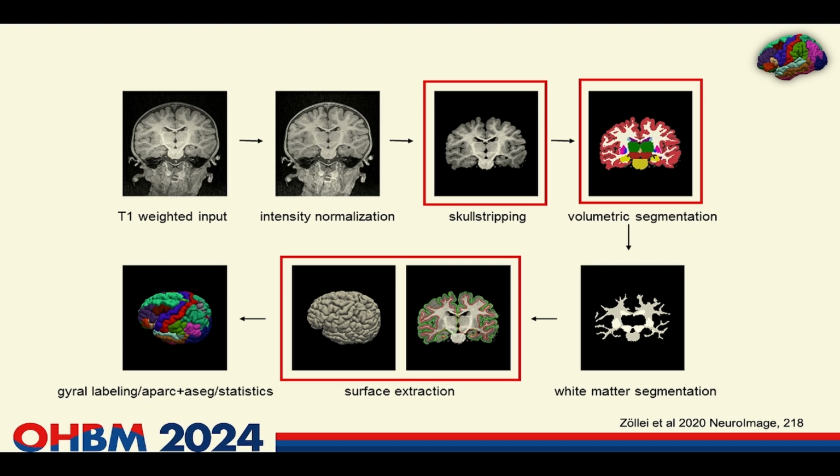So just a quick terminology: segmentation, parcellation, they are both annotations. In case of FreeSurfer, we usually refer to segmentation as the subcortical segmentation or annotation of areas, parcellation to the cortex, but these should be interchangeable. This is just our particular lingo.